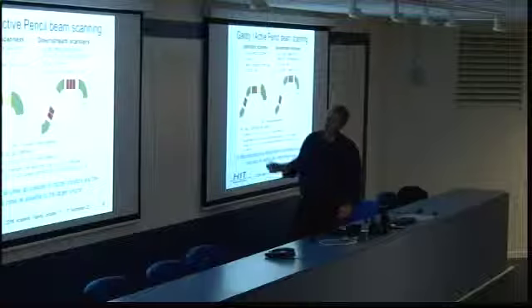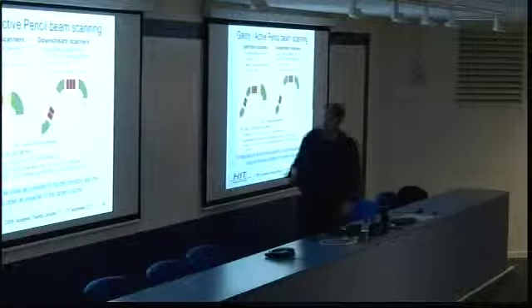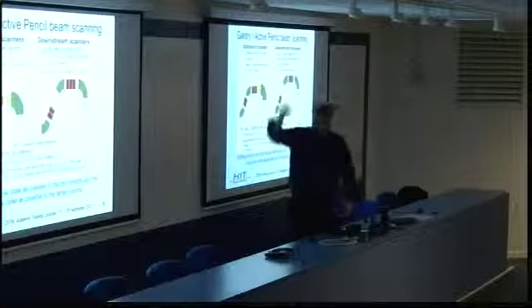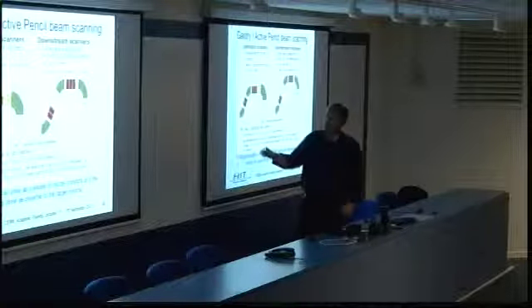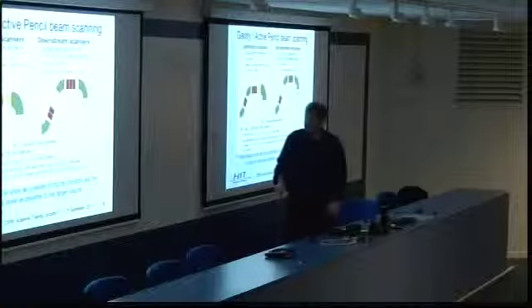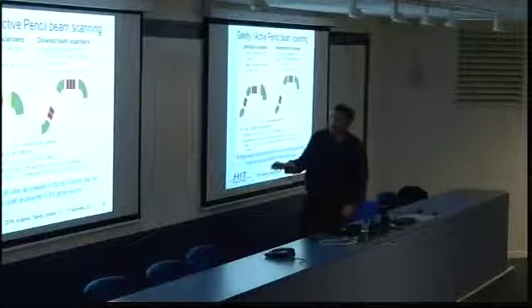So it's not easy to make this decision for protons, but for ions it's clear this never fit, as we would have a gantry with a diameter of 20 meters or more to bring out the beam afterwards. So we have to decide for such a situation. And you have to think about a lot of other things.